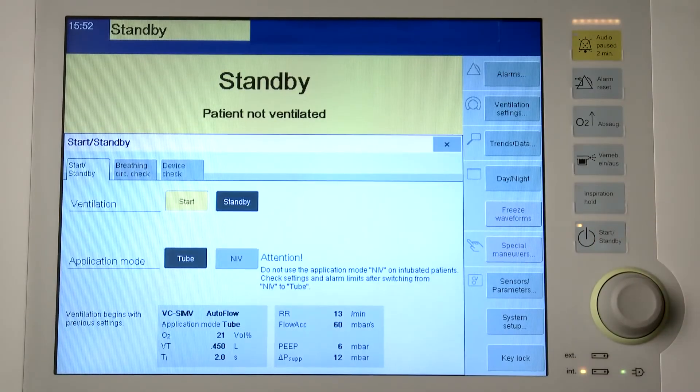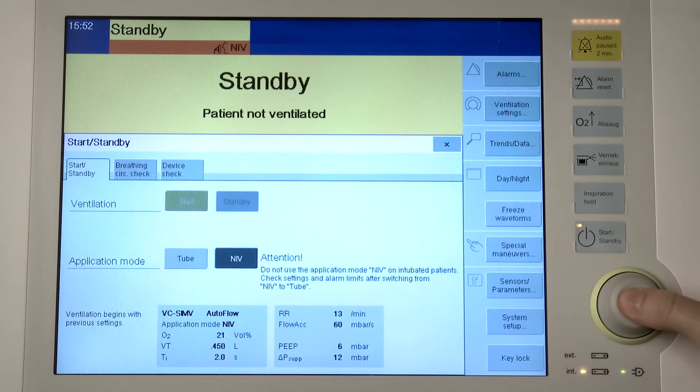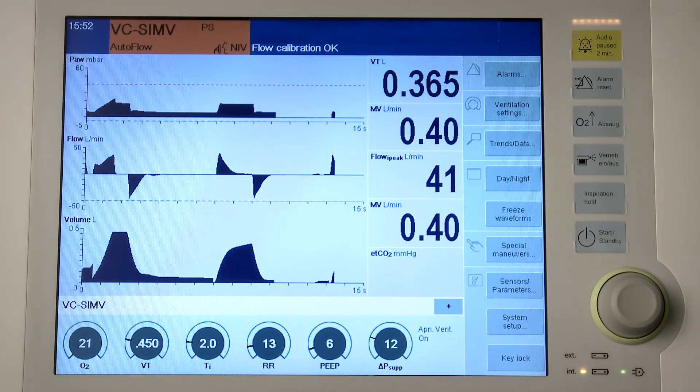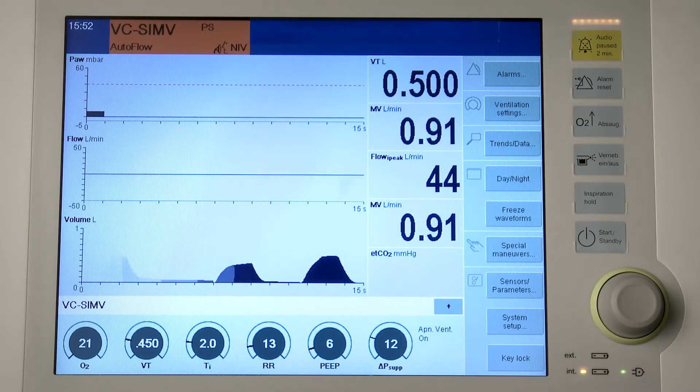Not all ventilation modes are selectable for the use of non-invasive ventilation in the NIV application mode. Leakages are greater with non-invasive ventilation than with invasive ventilation. Savina 300 takes into account the leakages in the NIV application mode accordingly. The inspiratory trigger is automatically adapted to the measured leakage. The measured values for tidal volume are leakage corrected and indicate the patient's actual tidal volume.